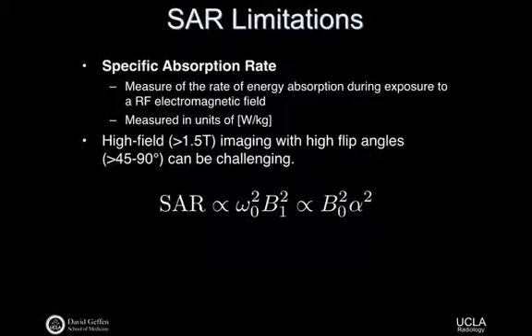So we basically covered this already, but this is the idea that we need to define some unit of measure for energy that's deposited in the subject, because of course we can't heat up our patients more than certain guidelines, or it's uncomfortable, if not unsafe. And I will tell you, the FDA has done a pretty good job of designing these constraints, meaning I absolutely can operate within FDA guidelines and make any one of you sweat, right?